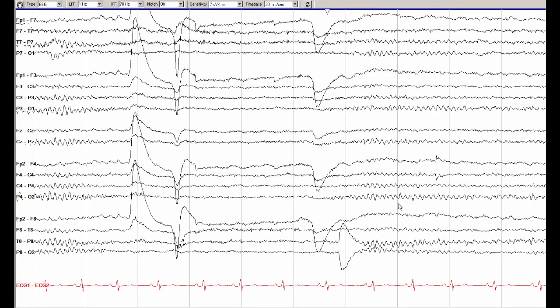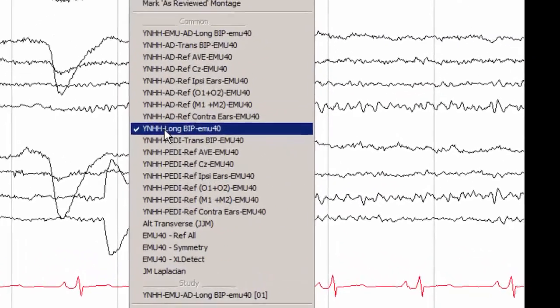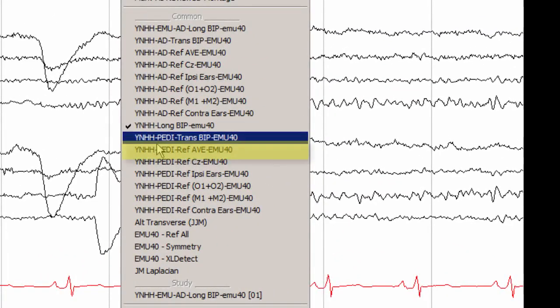After looking at the frequency of the alpha rhythm, we can explore its amplitude. As I have discussed in previous videos, there are no absolutes in EEG, as we are always comparing the signal at one position to the signal at another. Therefore, we can never get a completely accurate sense of the amplitude. However, in general, the amplitude seen on a referential montage gives a much better sense of the absolute amplitude in any particular head region in comparison to the amplitude on a bipolar montage when we are looking at the differences between adjacent electrodes. Therefore, on this EEG, we will switch to the average reference montage and review the amplitude of the alpha rhythm using this montage.